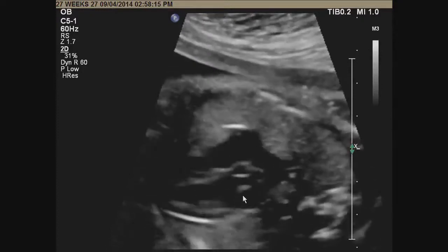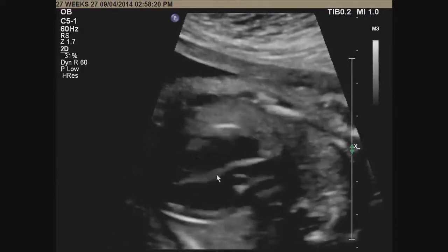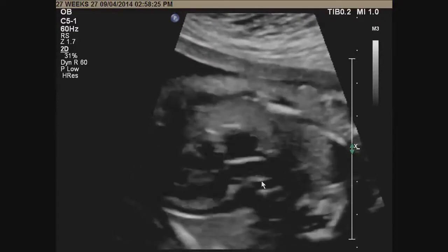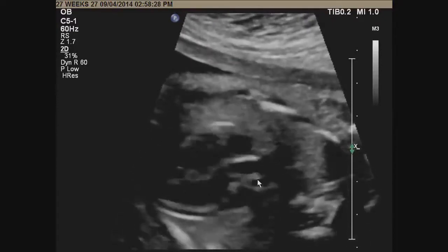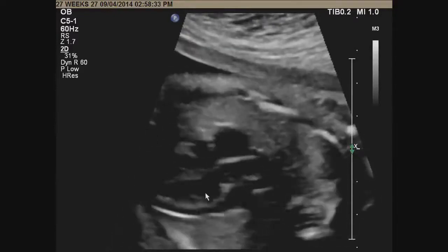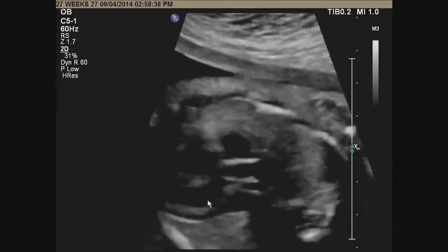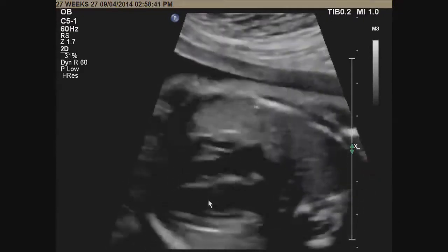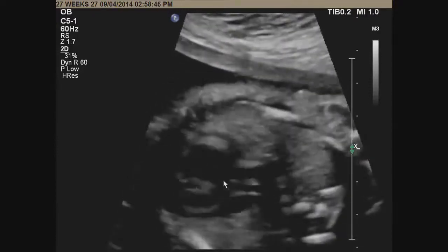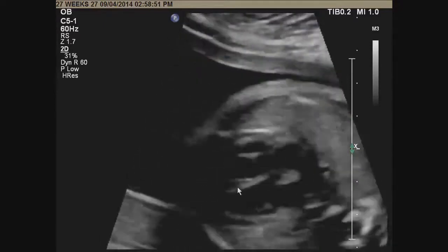The other important feature of this view is to look at the continuity between the mitral valve and the aortic valve. They are in the same plane, and this anatomic continuity is really what you look for when you're talking about double outlet right ventricle and so forth, where you lose this anatomic proximity and continuity between the two. So the mitral valve blood comes in and goes out through the aorta in the same anatomic plane. This feature is not available in the right ventricle. Inflow into the right ventricle is in one plane, and outflow is in a totally more anterior plane. So the left ventricle has this feature that's not present in the right ventricle.